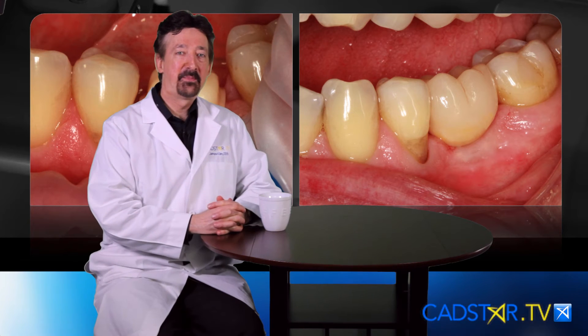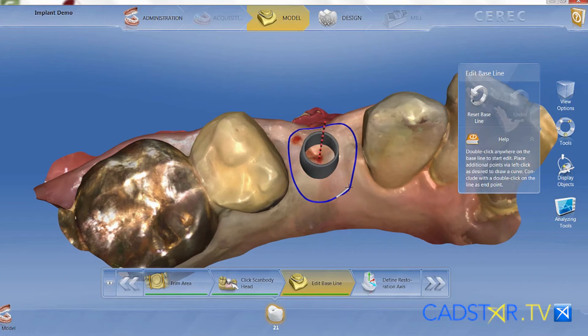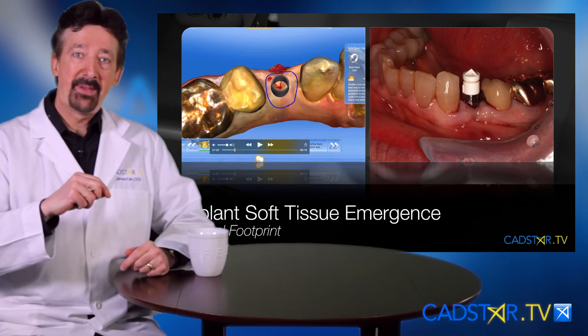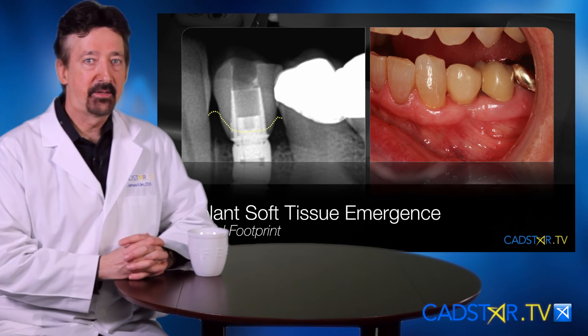What happens when the patient comes in and you don't have a pre-contoured soft tissue? Well, the principle is the same. I'll look at the soft tissue and draw that baseline ideal for the size of the root trunk, regardless of the condition of the tissue. One caveat: don't draw the baseline on unattached tissue — it just doesn't work too well. As long as you have attached tissue, when you draw that baseline on the attached tissue, you will find that the emergence to the baseline will be easier to design in the software.